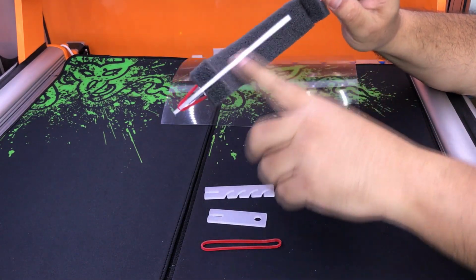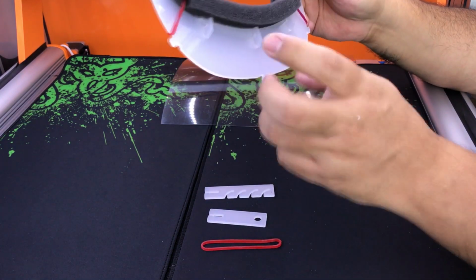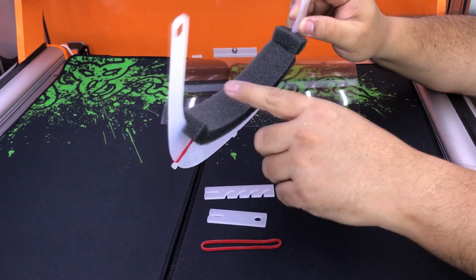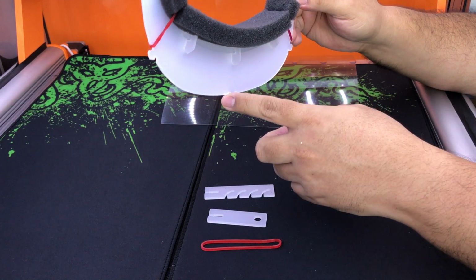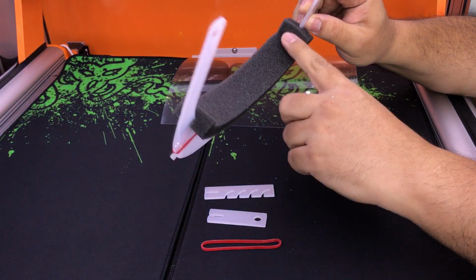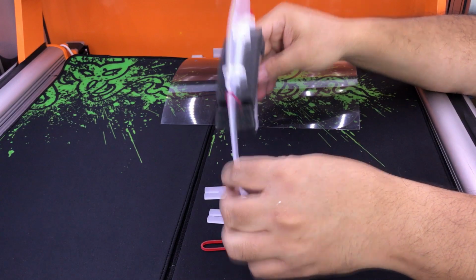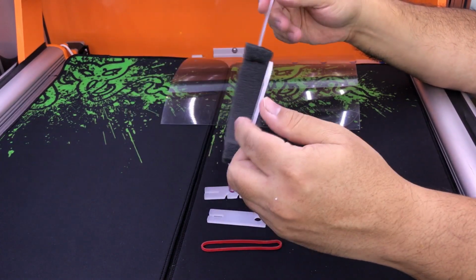And if this gets dirty, you can take it out and clean it. That's one of the advantages, not using any glue. And also you can make several for each mask, so you can give them away with several replacement parts like this, and if they get used, they can throw it away and put a new one, because this part can be disinfected many times, and it doesn't get damaged.